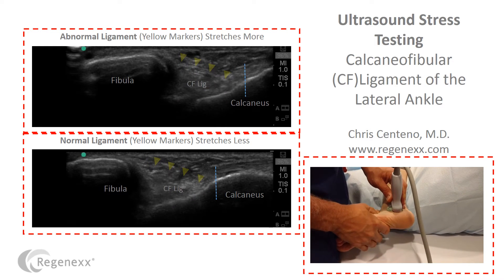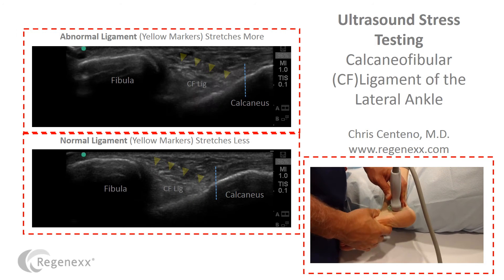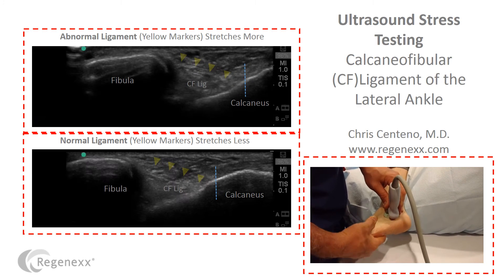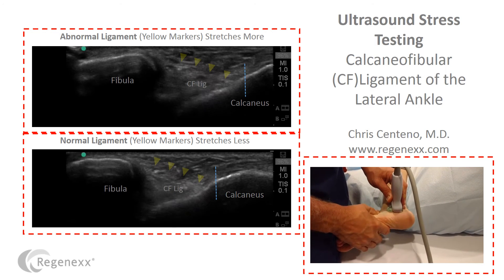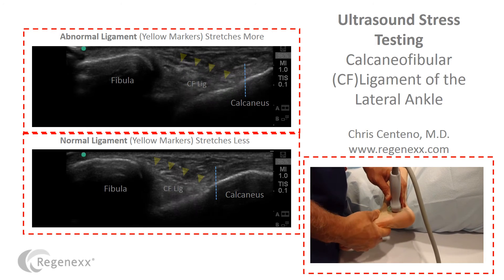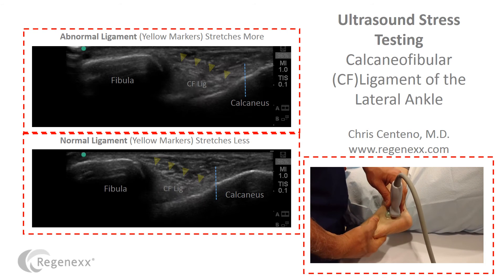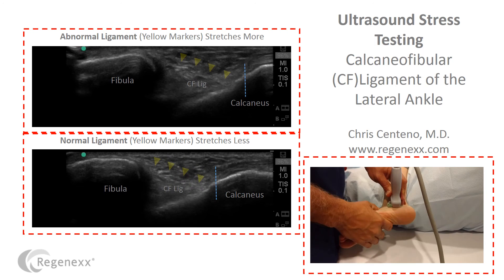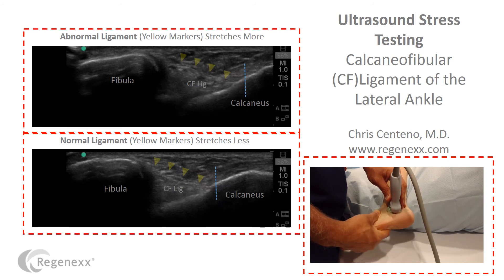Comparing those side to side, focus on that CF ligament — you can see much more stretching on top than on the bottom. The top one is a clearly abnormal ligament. It's easy enough to fix. We can inject precisely under ultrasound guidance: platelets if the ligament is not too severe, or stem cells if the ligament is more severe. That will help tighten up the ligament and repair this kind of stretchy ligament damage.